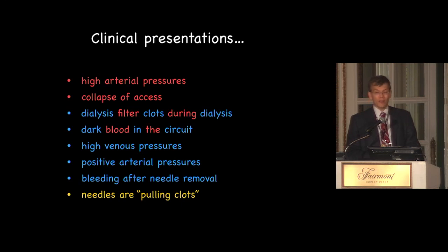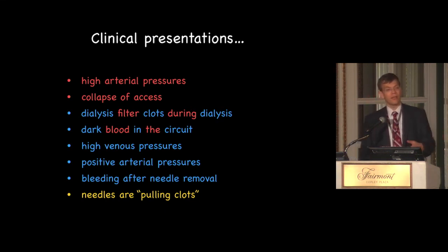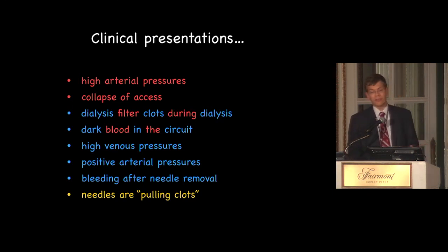When needles are pulling clots, in my mind, there's no real clot in the access. Typically either the tip or the back hole of the needle is outside of the access. This can be due to poor augmentation, side branches, poor needling technique, the vessel being too deep, all kinds of things. But needles pulling clot basically means the needle is not in the right position.